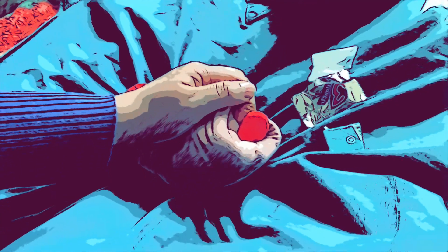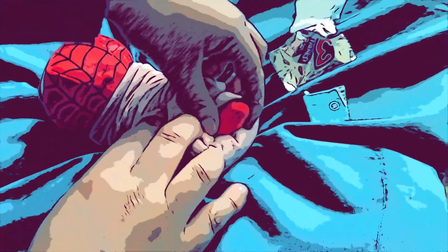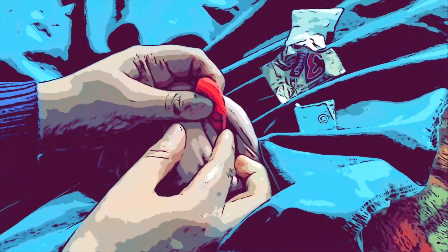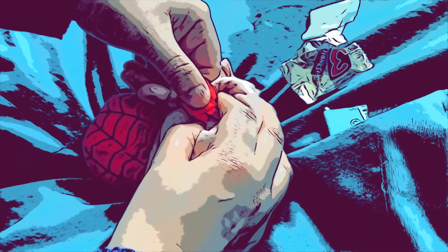The baby sometimes falls asleep when I poke them because they're already snuggly. When you do a heel stick, there's a spot you're not supposed to even touch — you have to be very careful. Put your thumb exactly right there on the off-limits zone, and then you're safe to poke in the correct area.